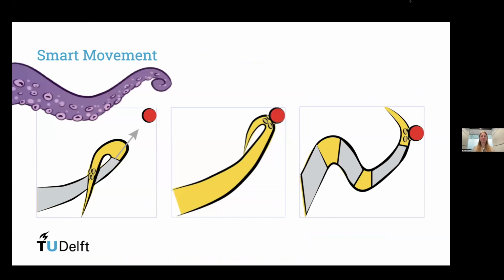That's part of the research we're focusing on: creating similar types of movements in catheters so that we can, for example, reach and extend, but also, once we reach, make an articulated structure with joints at specific spots, which of course makes for higher adaptability to the dynamic environments inside the body.